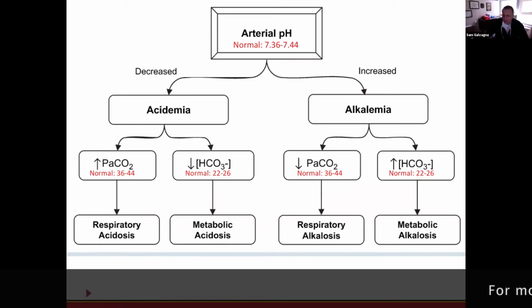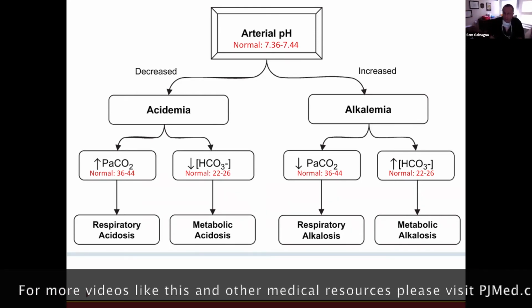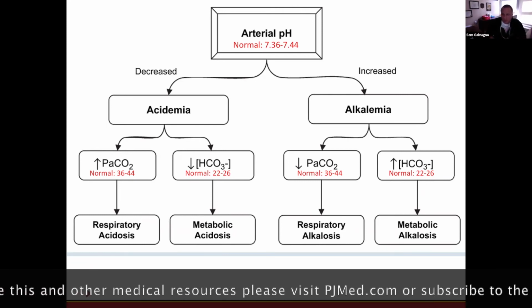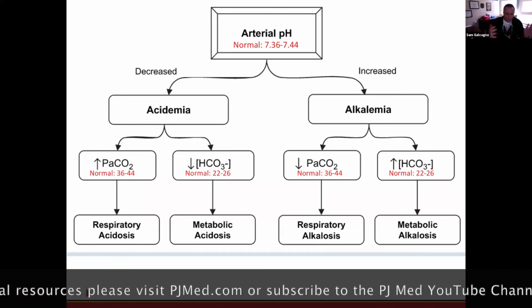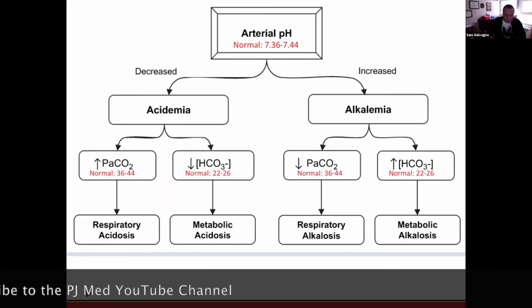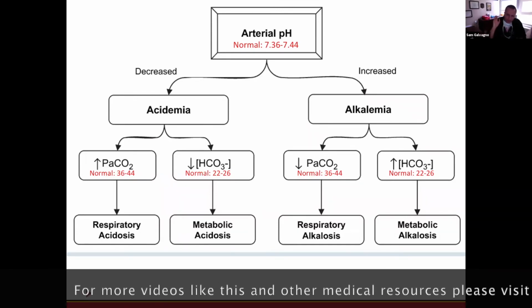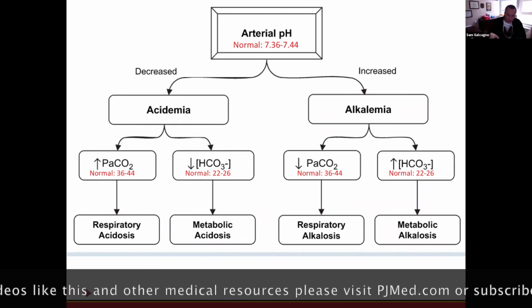Guys, this is the kind of stuff that we would expect if you're with me, now at the Javits Center, or if you're with me at the Baltimore Convention Center, and we're leading a team of you, 4 or 5 of you following 1 or 2 patients each, or just 1 patient each. This is the kind of stuff that really helps us, because if you come to us with a solution like, hey, doc, got the ABG, got some alkalemia, I did some calcs, I think we need to adjust the vent, I think we need to come down on the rate a little bit.